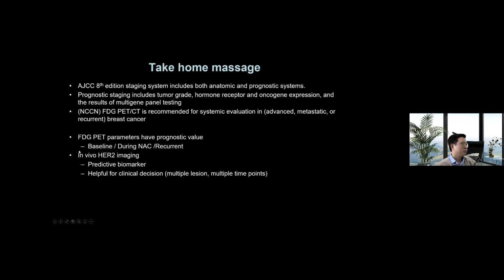And the last part of my talk included PET imaging for better stratification of patients to give precise medication with the finding of the imaging, which is far better than biopsy-based evaluation. So that was it for today.